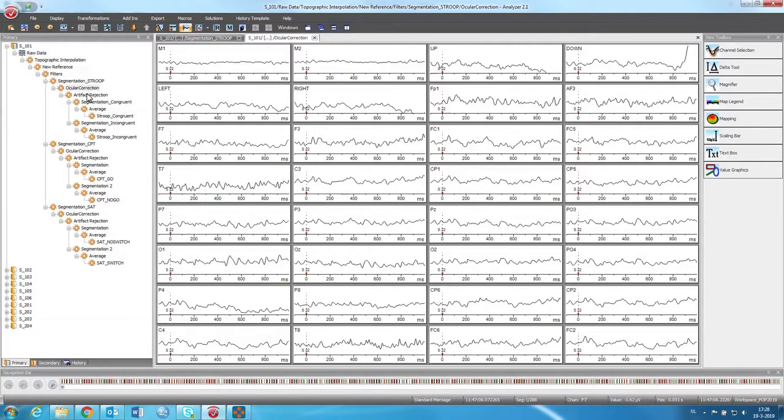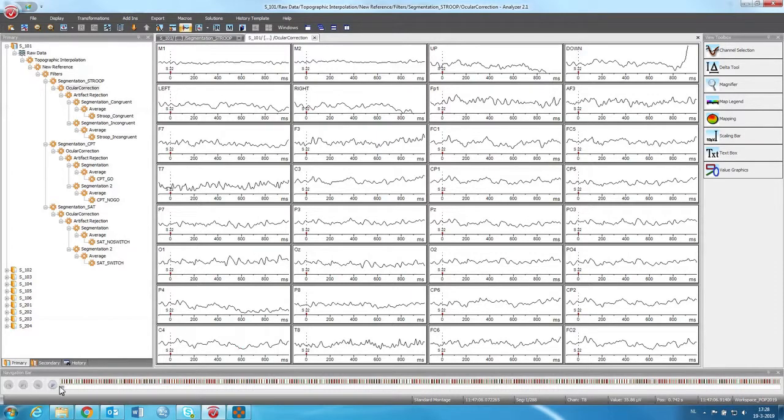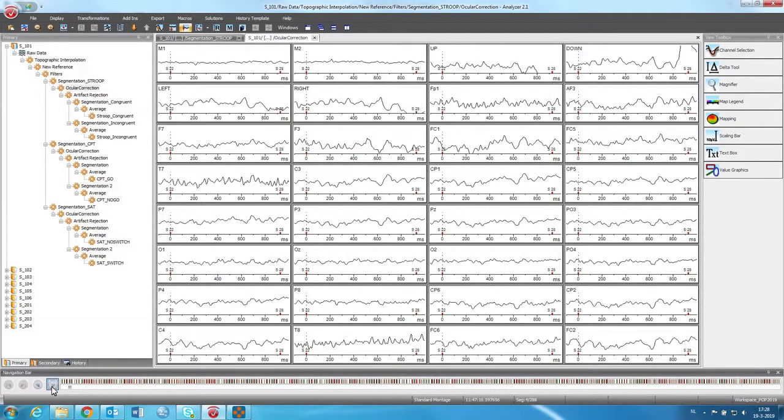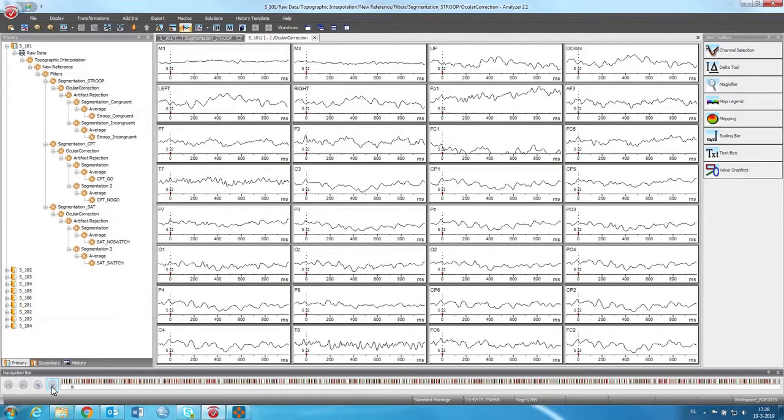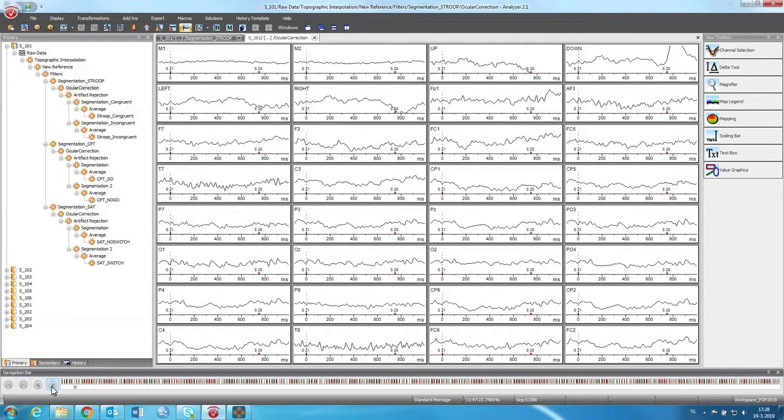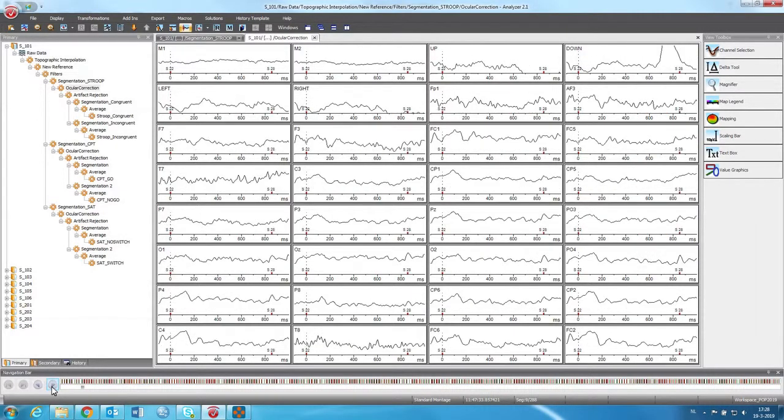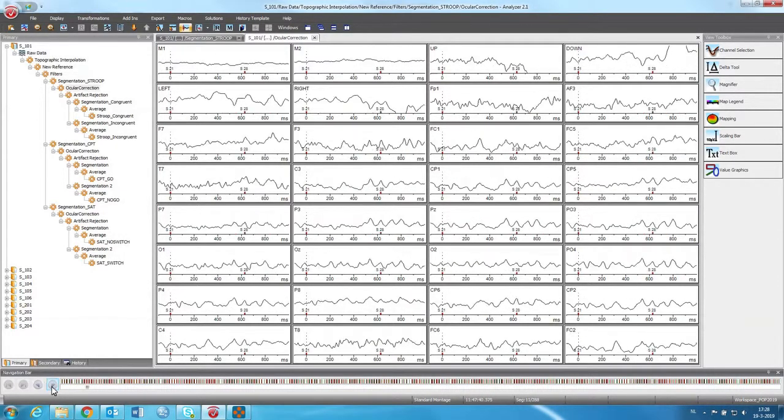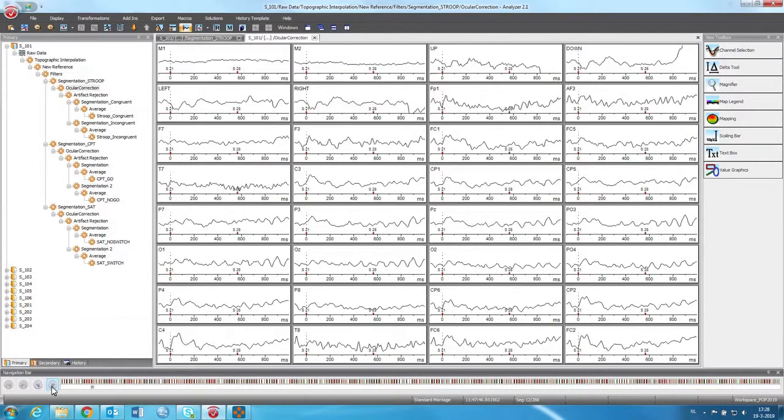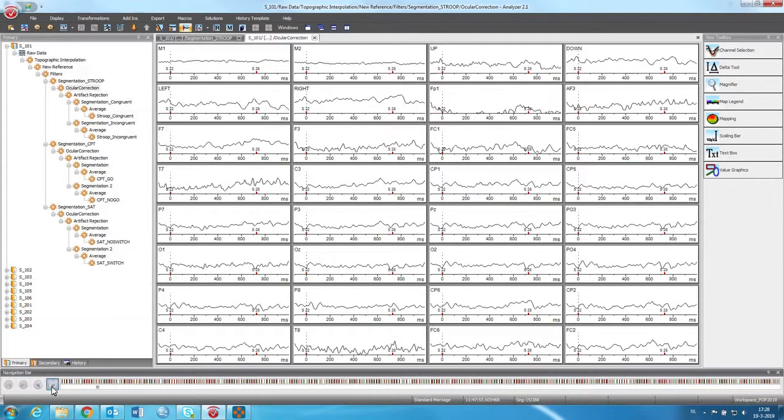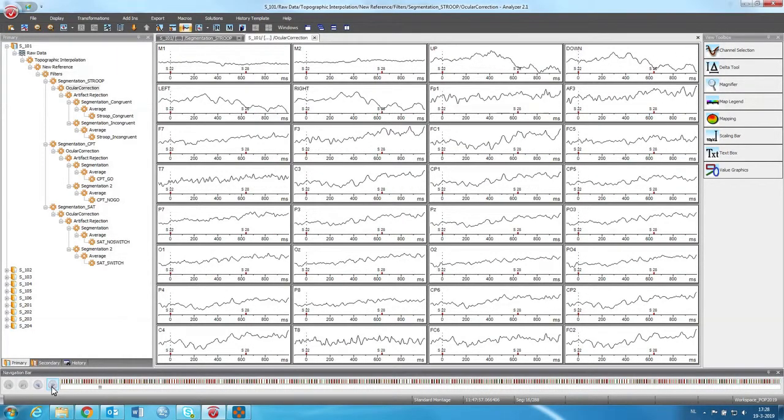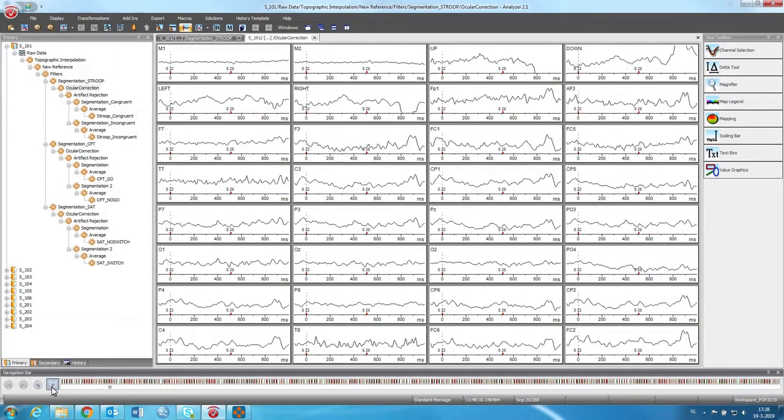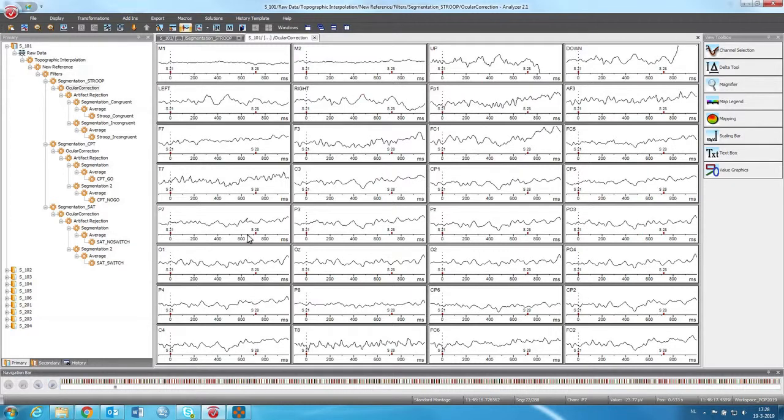Then the next step is the artifact rejection. So you can already see that if you scroll through the data, some of the events don't look so great. Maybe there is some movement. Actually these look pretty okay, but there may be some movement in there. And then it has to be removed.